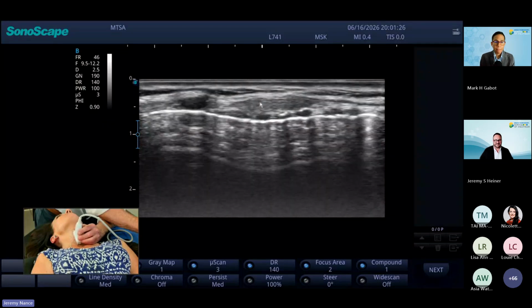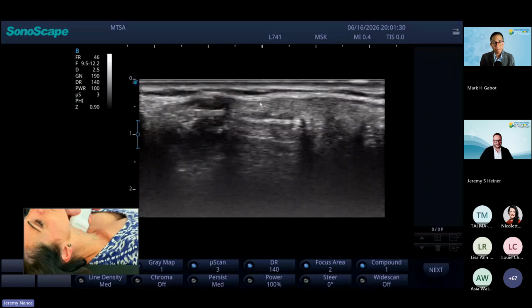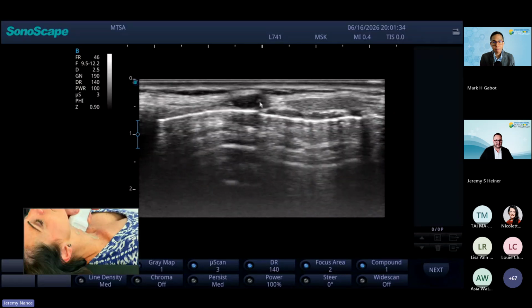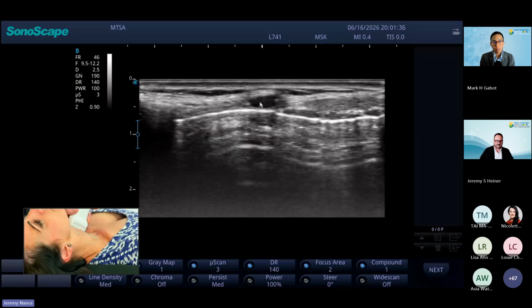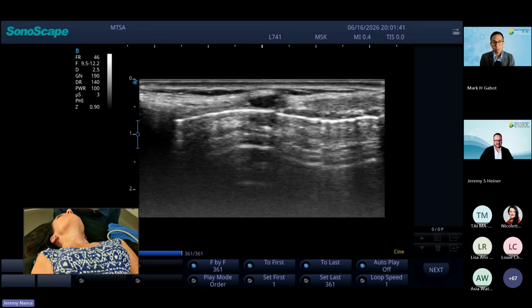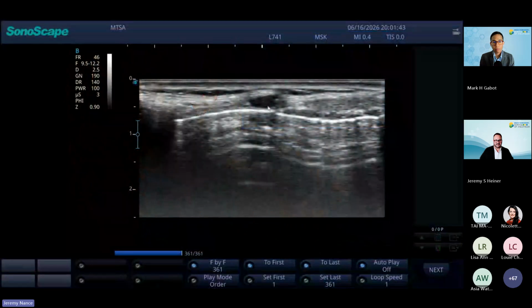It is the largest. I always call it the mother pearl. And we will continue to scan proximally until we start seeing acoustic shadowing from the thyroid cartilage. So again, here, we are now in a longitudinal view. And if we take our pointer, we can see our tracheal rings. We can see the cricoid cartilage right here.